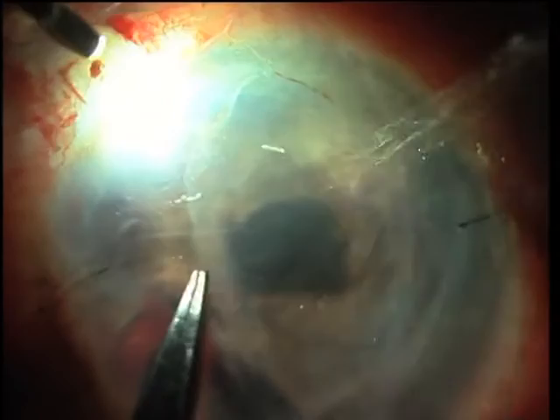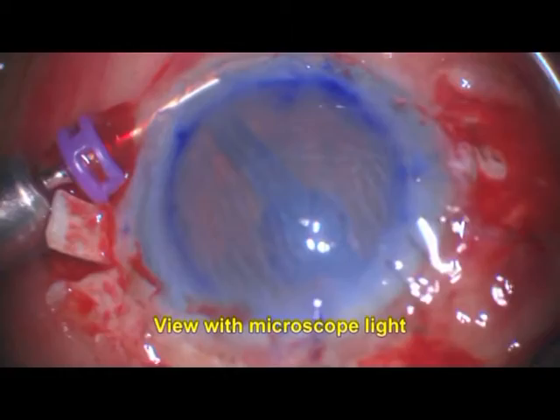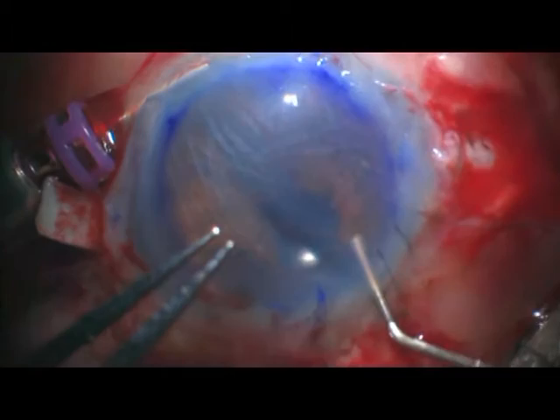Using just the endoilluminator light gives very good clarity to the surgeon, as opposed to the microscope light where it is very difficult to make out whether the graft is facing upwards or downwards. The entire surgery from the point of insertion of the graft up to the flotation of the graft can be carried out using just the endoilluminator light alone.